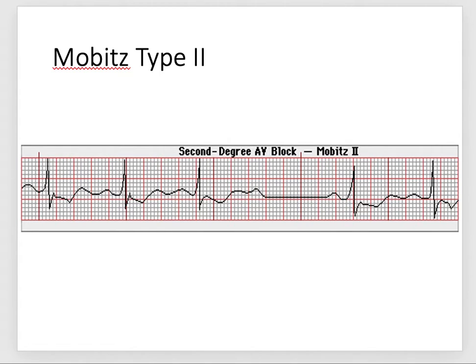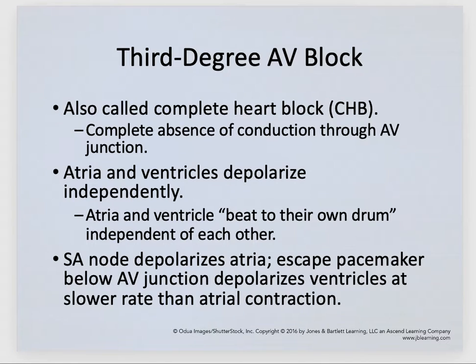The other one I haven't mentioned is a third degree. Third degrees are something we don't see a lot in cardiac rehab, right? We call this a complete heart block. It's something I don't commonly put on a test because you need to know they exist, but recognizing them can sometimes be tricky because sometimes they look like something else is going on. But it's something I'm not that concerned with in a cardiac rehab setting, because most people by the time they get to a third degree, they just aren't well, right?